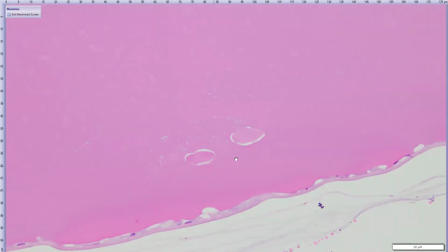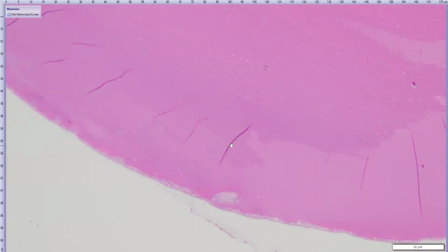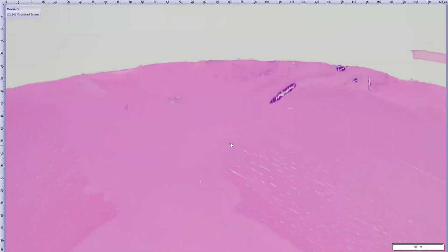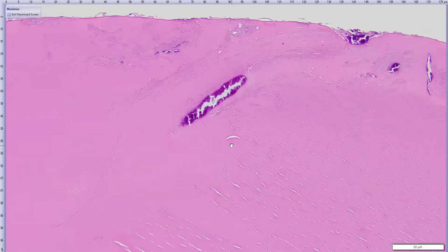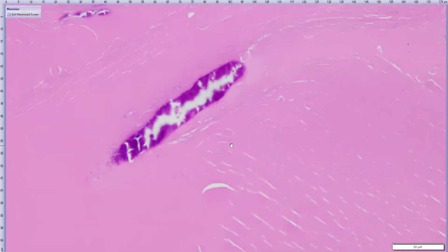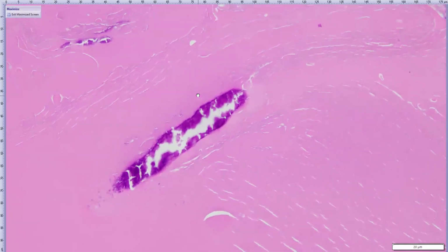And some of them start to round up and form these more Morgagnian globules. And from lower power, we can see those changes in the cortex kind of go circumferentially around the lens. And then we also have a little bit of this deeply basophilic granular material within these liquefied lens fibers. And so we have some mineral accumulation here, which is another feature of cataracts that we can see. And so since this goes circumferentially around the lens cortex, in the Coplow world, we would call this a mature cortical cataract.